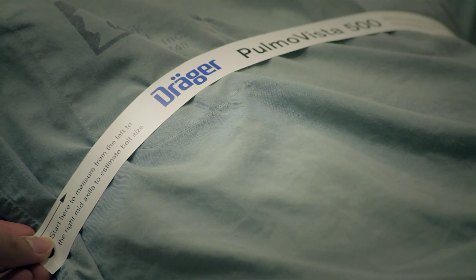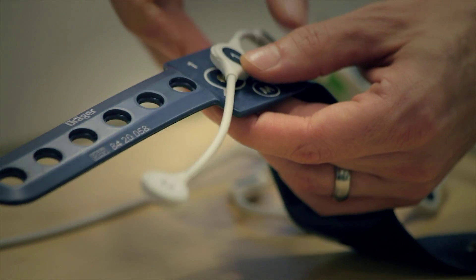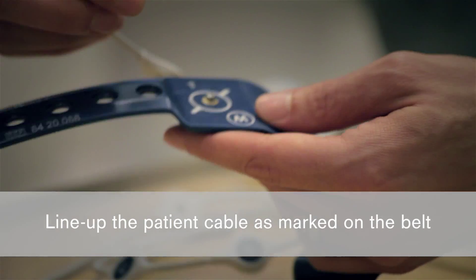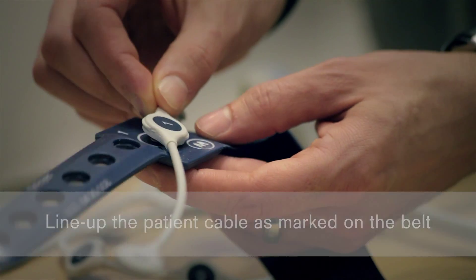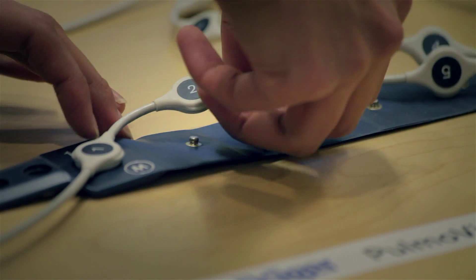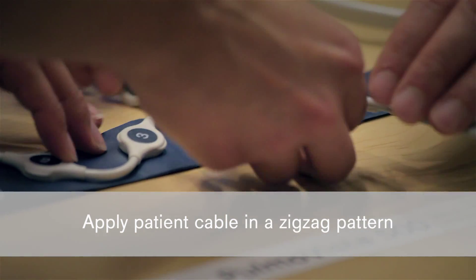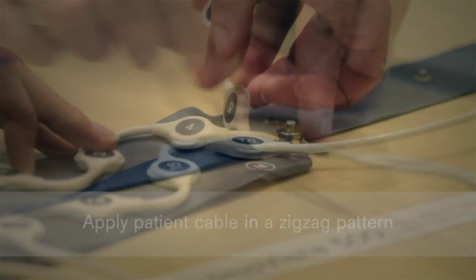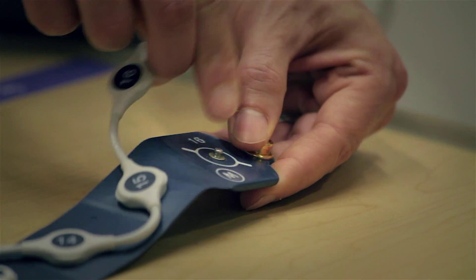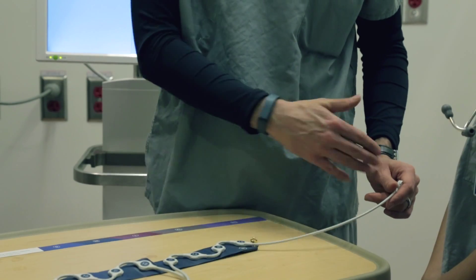Let's assume that we have medium as our size. You can see this line here — you need to line up the cable with the white lines so that the connection part is on the outside of the belt. You don't want to start it with the connection on the inside; keep that on the outside. It's easier if you do it on a flat surface. Go ahead and connect these in a zigzag pattern, and I'll show you why when we're done. By the time you get to the end, you should be covering the same symbol as on lead one, with the end of the lead on the outside of the belt.